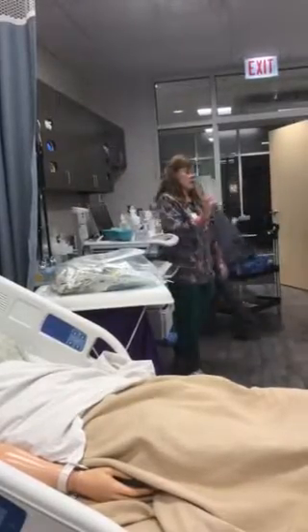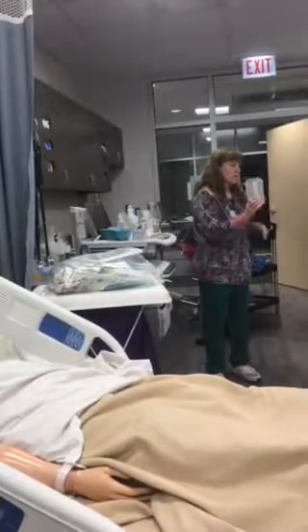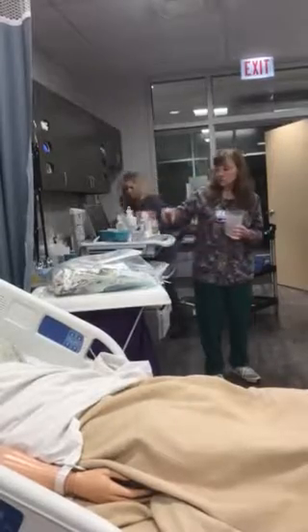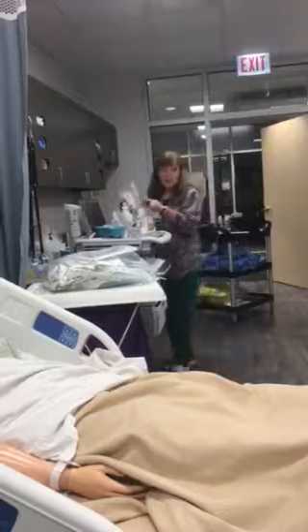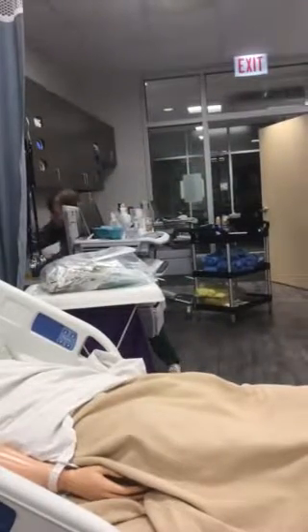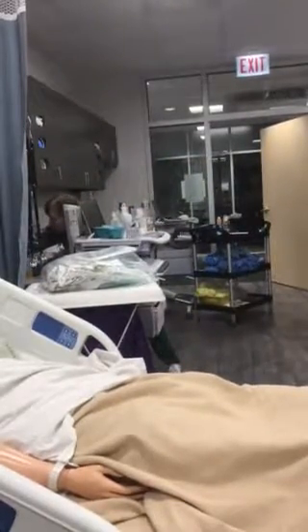You guys will get even your favorite cylinders. This one's my favorite because guess what? I can actually read it. This one is much harder to read because it blends in with the plastic. So we're going to pretend like we put the Jevity in here. How many milliliters is the Jevity?